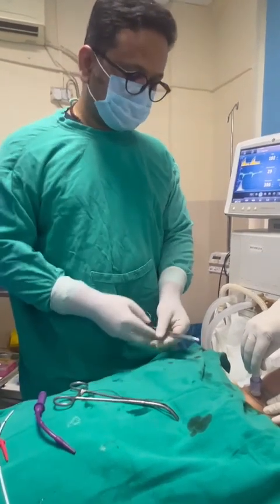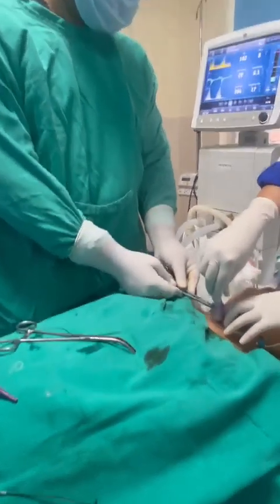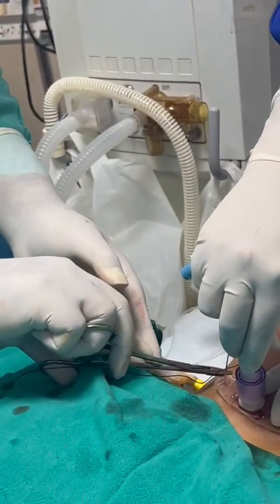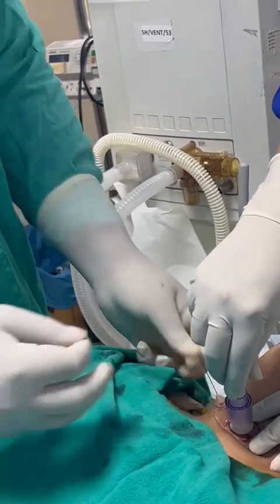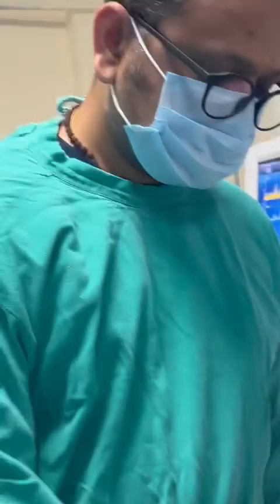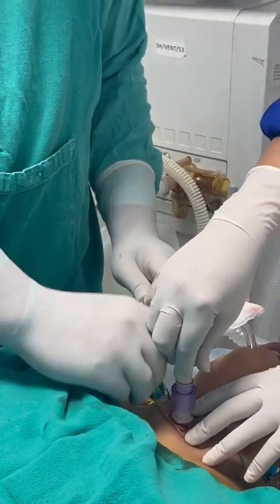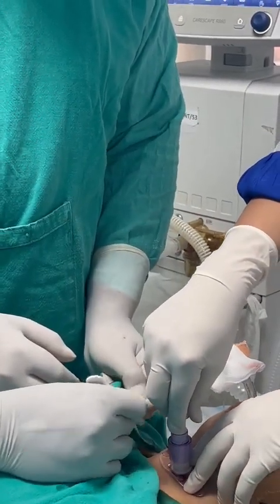These are all difficult cases because normally PCT is recommended when the anatomical landmarks are very clear. If the anatomical landmarks are not clear, then you should ideally not be doing it. Why? Because you don't know which plane you are going into. Can there be a risk of injury to the thyroid gland?